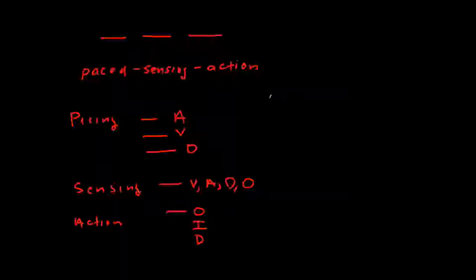So type of pacemakers or type of settings that you'll see would be AAI. So that's an atrial pacemaker that is looking for atrial activity, and if it senses it, it will inhibit it. There is AOO, and these aren't type of pacemakers. These are modes that you're actually dialing into the box. And that is something that is just basically pacing the atrium at your set rate. It's not sensing, and because it's not sensing, it's not inhibiting. So that's AOO.